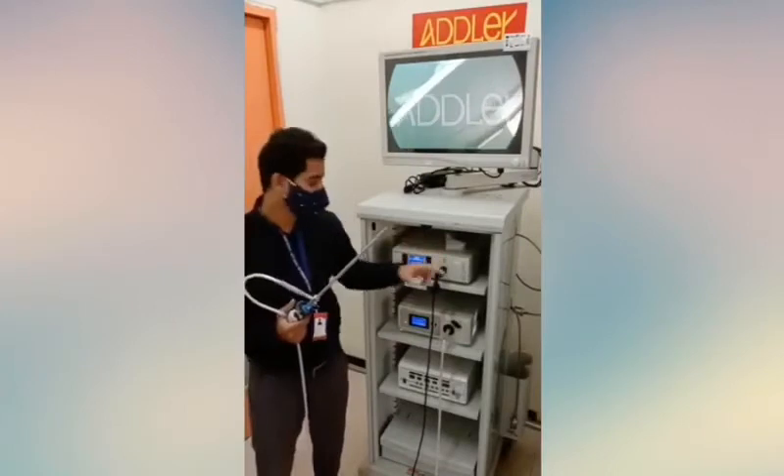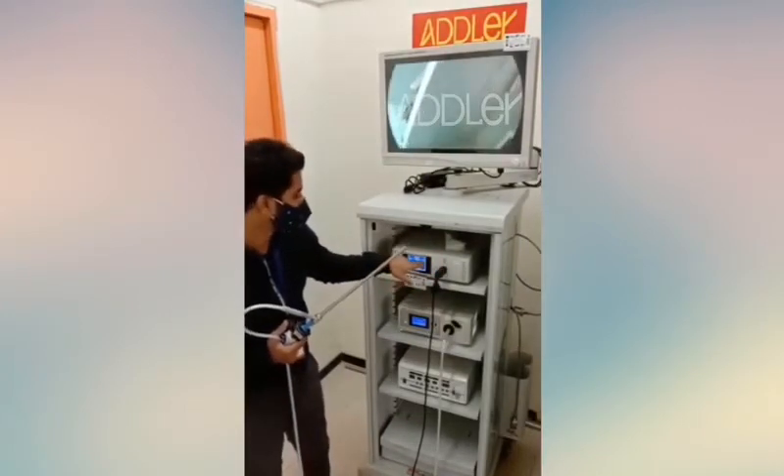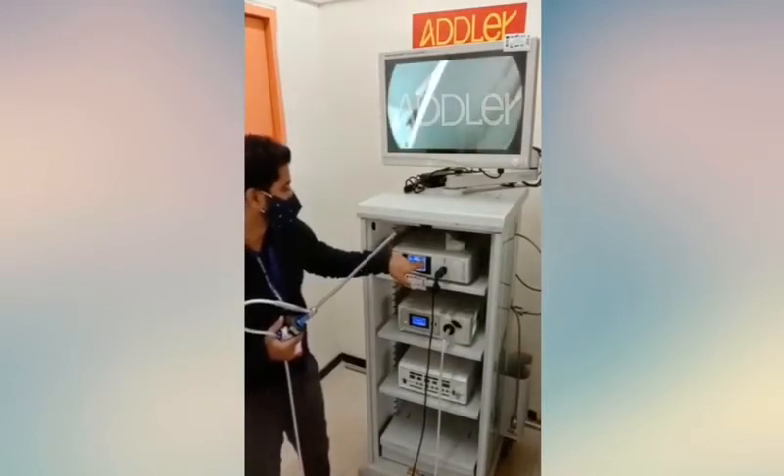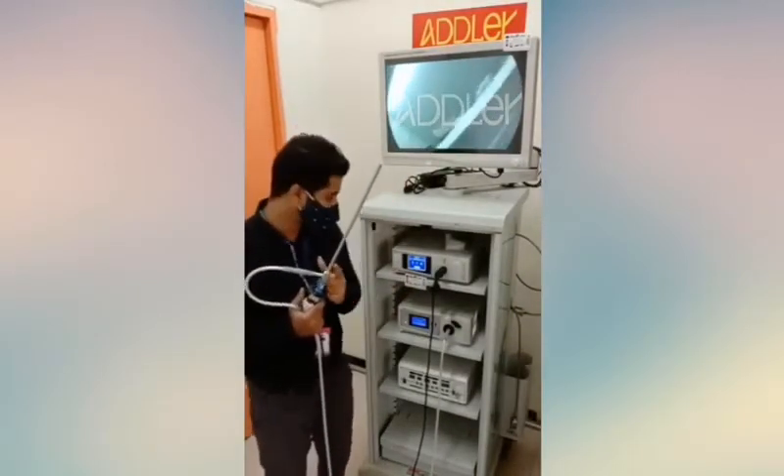To change a specialty mode, out of the 9 modes available — for example, standard to laparoscopy or arthroscopy — you simply need to touch the arrows on the screen. I'm using the laparoscopy setting, as I have a laparoscopy scope here with me.